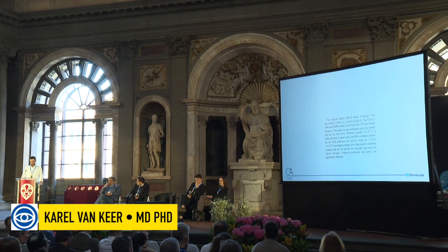If there was a difference of larger than 0.125 diopters, what are the chances that we didn't detect it in this study? So kind of power calculation. And there the p-value was well below 0.001. So in conclusion, there is a clinical equivalence between both devices in predicting IOL power.